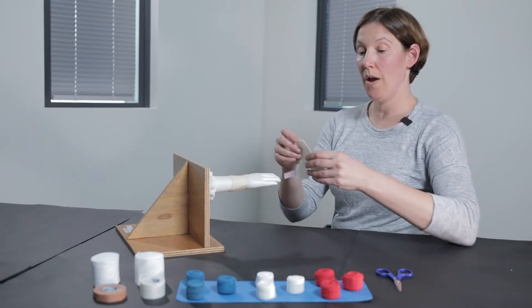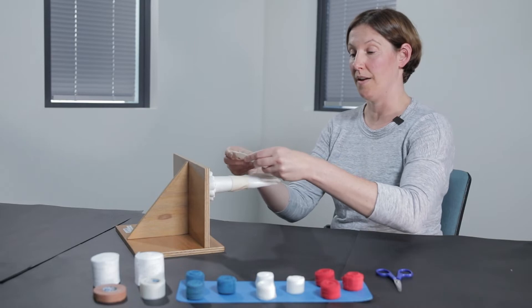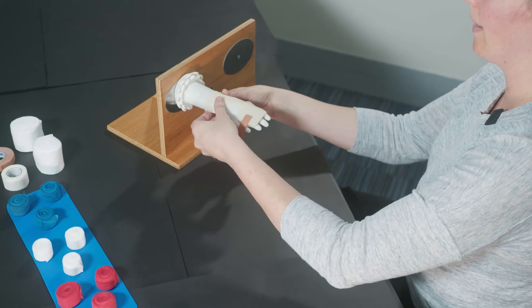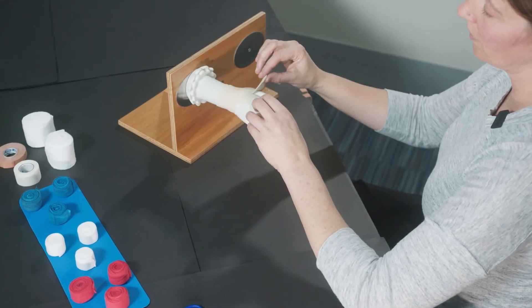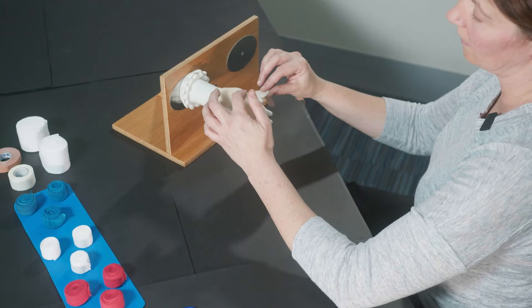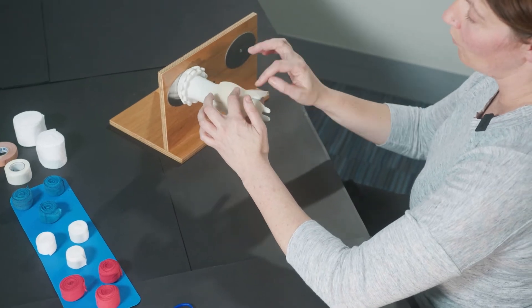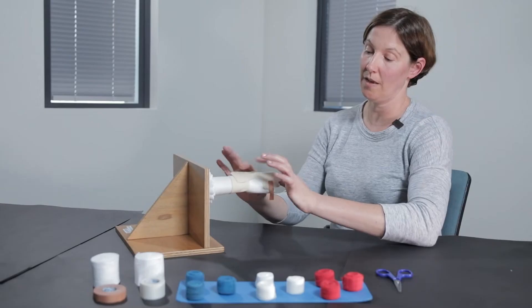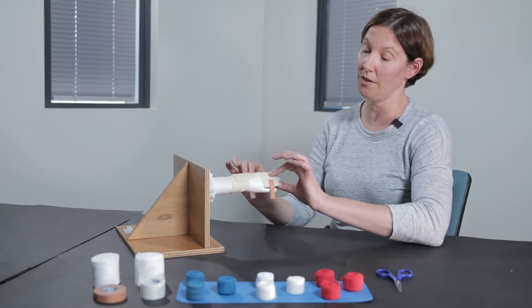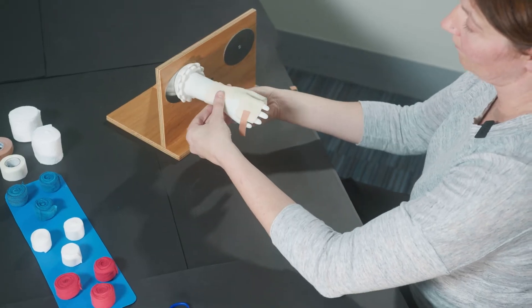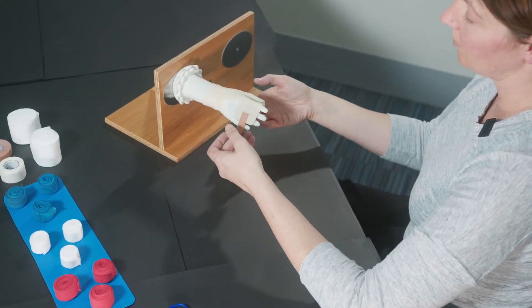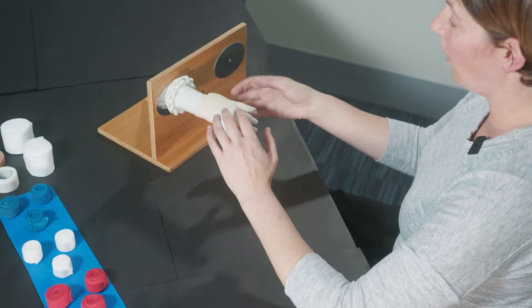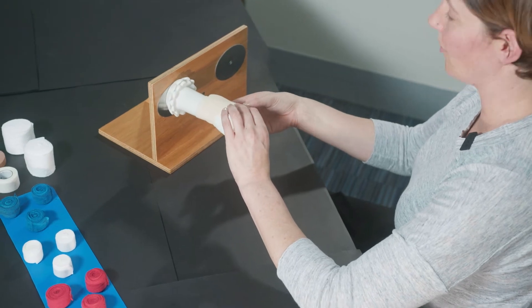I'm going to share a way of wrapping two fingers that are side by side. The first thing we're going to do is secure the dressing at the back of the hand, and what you're doing is lining up the slit that you've placed in your dressing with the web space. You're covering each of the fingers at the back, and today I'm just doing the thumb and the index finger. You're laying that down gently on the hand, and as you can see, I've pre-prepared sticking small pieces of tape to the dressing. I've done that just to make it a little bit easier to secure in place.